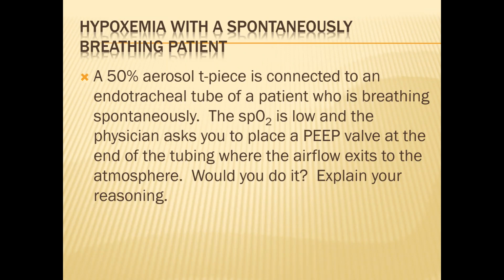They just have a tube in their airway and they are on an aerosol T-piece. You wouldn't. So if they ask you, don't do it. You would stop the air from flowing. How would the patient get a fresh supply of air coming to their endotube if you plug off the end of it with a PEEP valve?